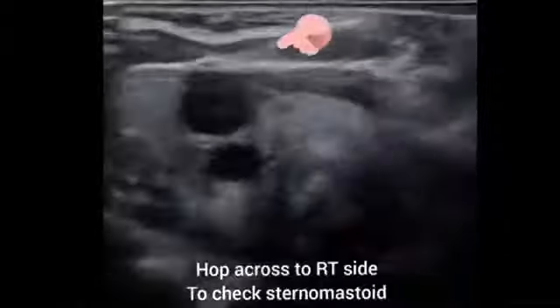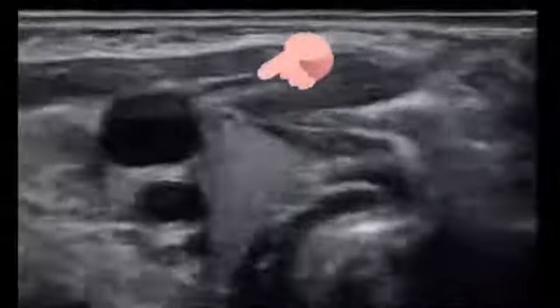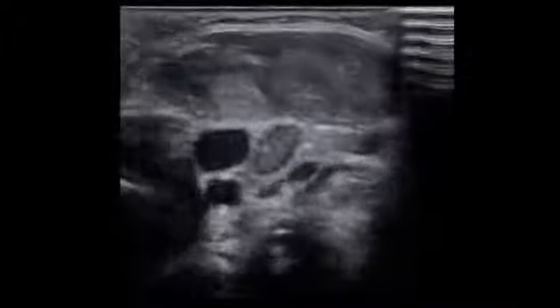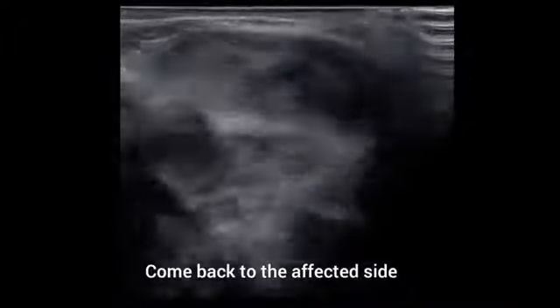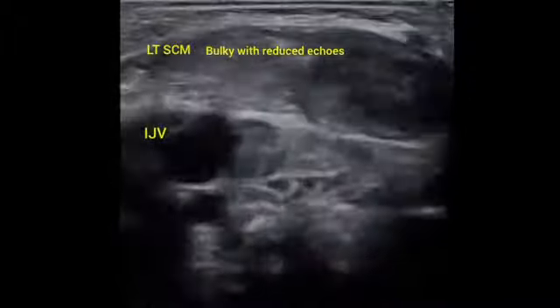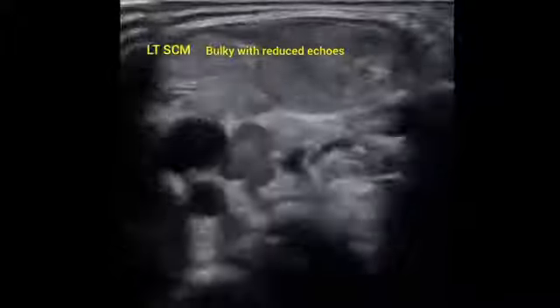We come to the right side just to compare, and you can see the flat, normal, smooth sternocleidomastoid very well seen. You see the thickness and you compare it with the left side. So let's go back to the left side, and again you can see a very thick muscle, and you know that this is a bulky and large sternocleidomastoid. No mass seen within it. Forceps delivery. The diagnosis here is pretty simple. This is fibromatosis coli or sternocleidomastoid tumor.